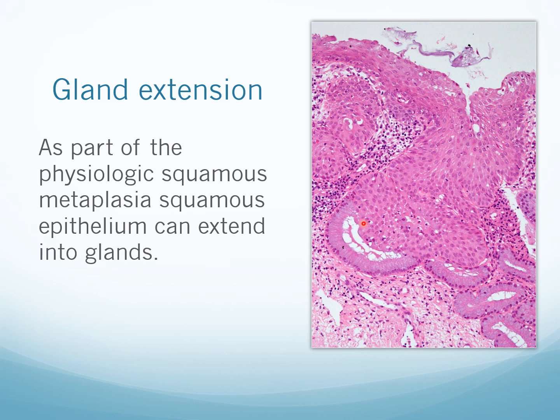This is important because later we're going to be looking at squamous cell carcinoma. Just because the squamous epithelium is inside glands, this does not imply dysplasia or malignancy. It is a normal process.